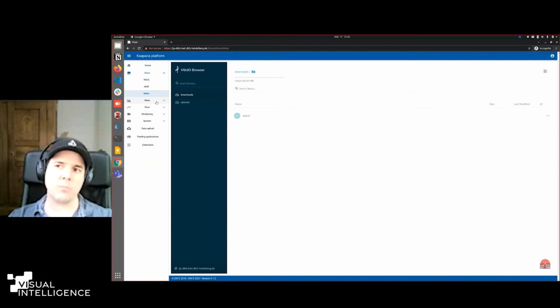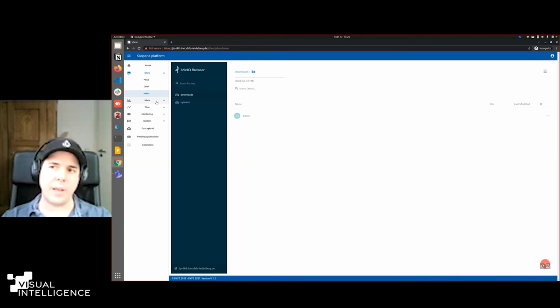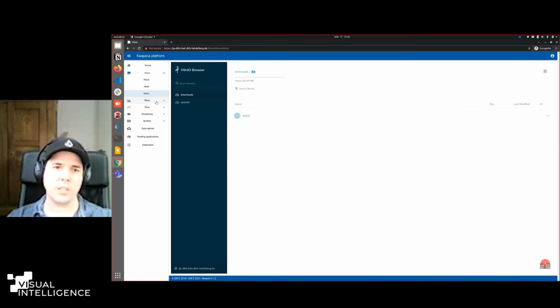One is DICOM, and this will be stored in the PACS I just showed you. And the second is everything that is not DICOM, which will be kept in this object storage, which is an S3 compatible object storage, like it's also very famous in the cloud computing community. Just basically a distributed file storage, which also allows us to, for example, generate download links and manage data in a very efficient way.